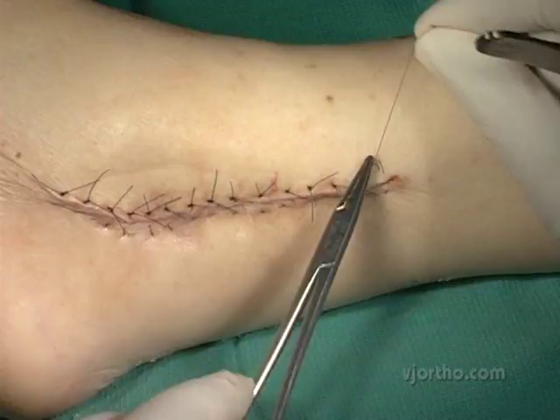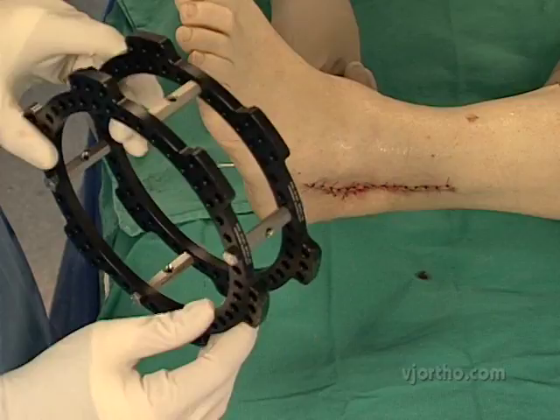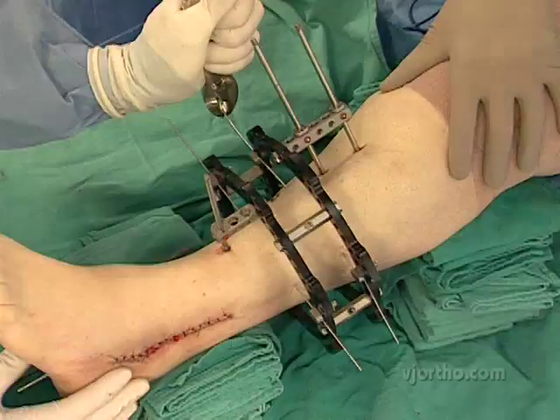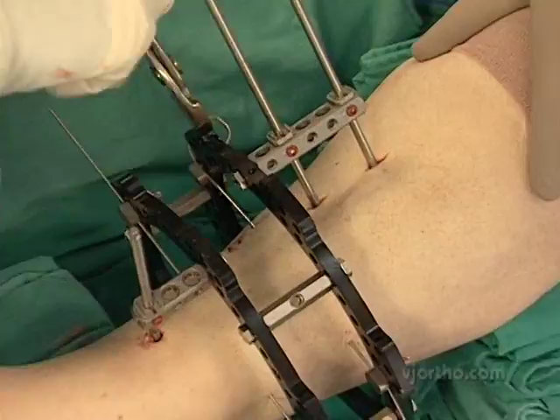I have this proximal ring block here — just two full rings connected with sockets. This can be varied, but having two rings allows more options and perhaps slightly more stability. I've cut the pin on the bottom of the foot to allow me to slide this over; had I not cut that pin I would have had some difficulty. I'm going to bend this around the ring, creating a little square, and then plug it into one of the holes so that it can't bind up.